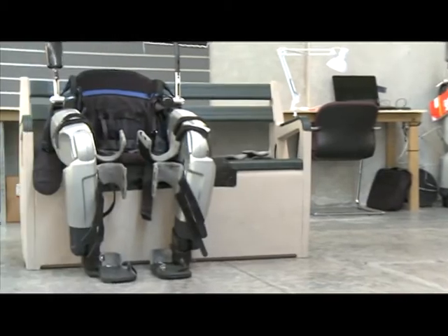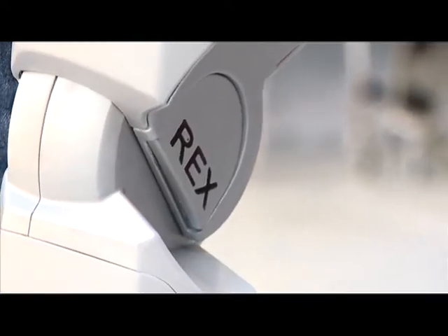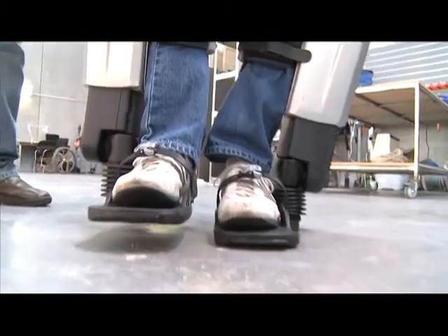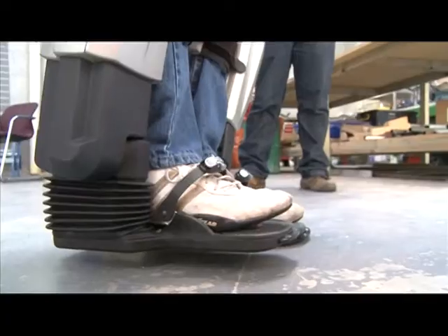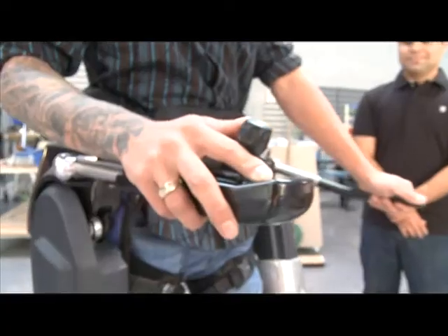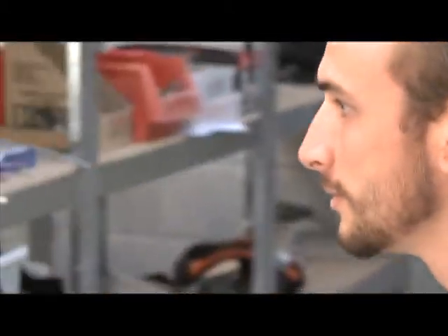I find the Rex legs are really easy to use. It took us about three days to get myself fitted properly and end up walking around. From someone that hasn't walked for five years, I would have expected it to take longer, but it didn't. Once you know the functionality and movement of the legs, it becomes extremely easy.